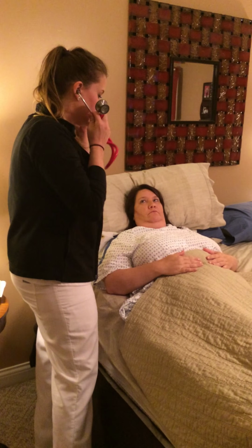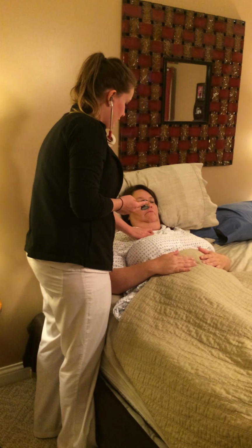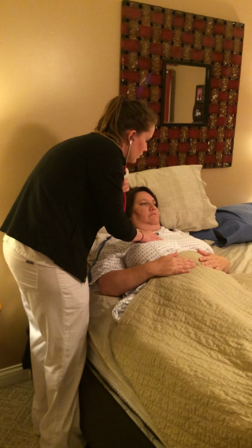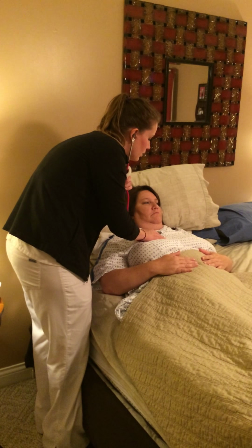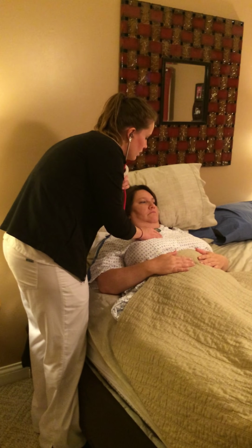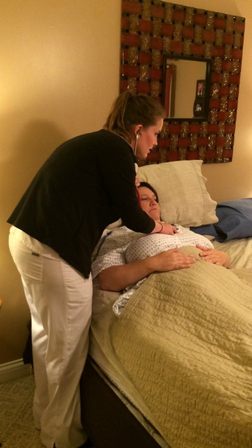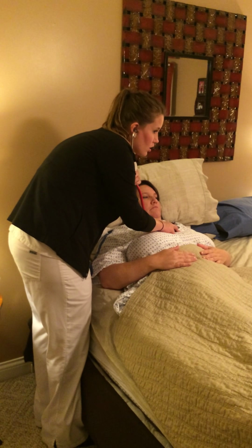Now I'm just going to listen to the heart sounds where I palpated. I'm going to go to the second intercostal space and listen to the aortic area of the heart. Going to the left side of the second intercostal space, listening to the pulmonic area, noting any murmurs, any extra heart sounds.